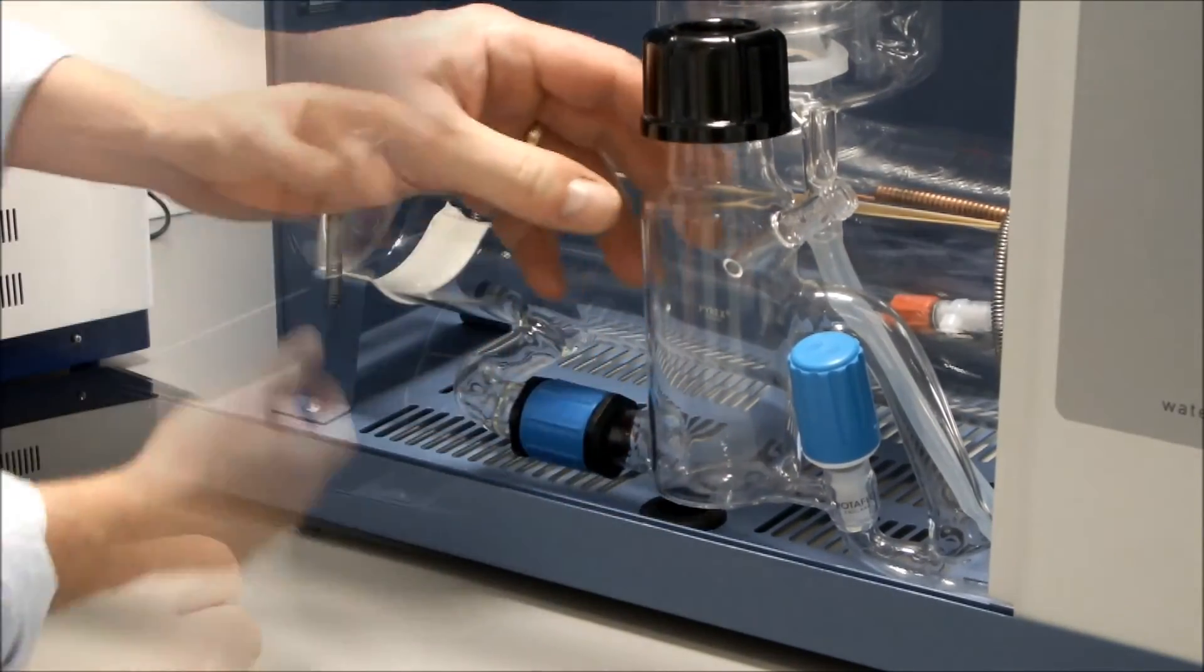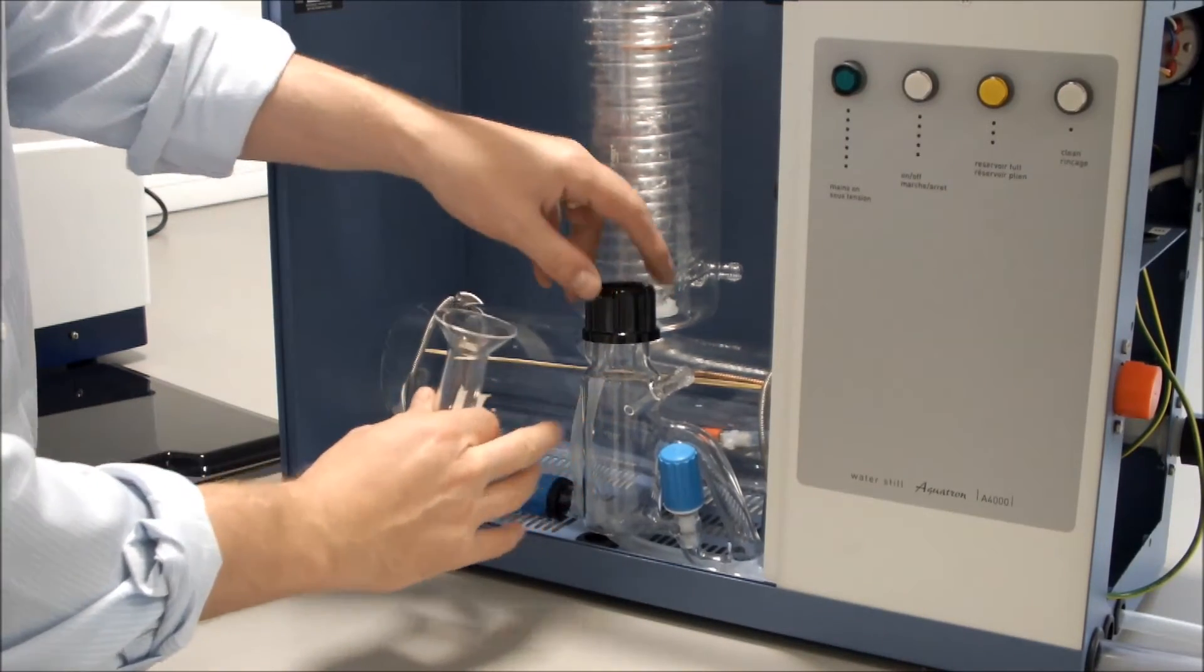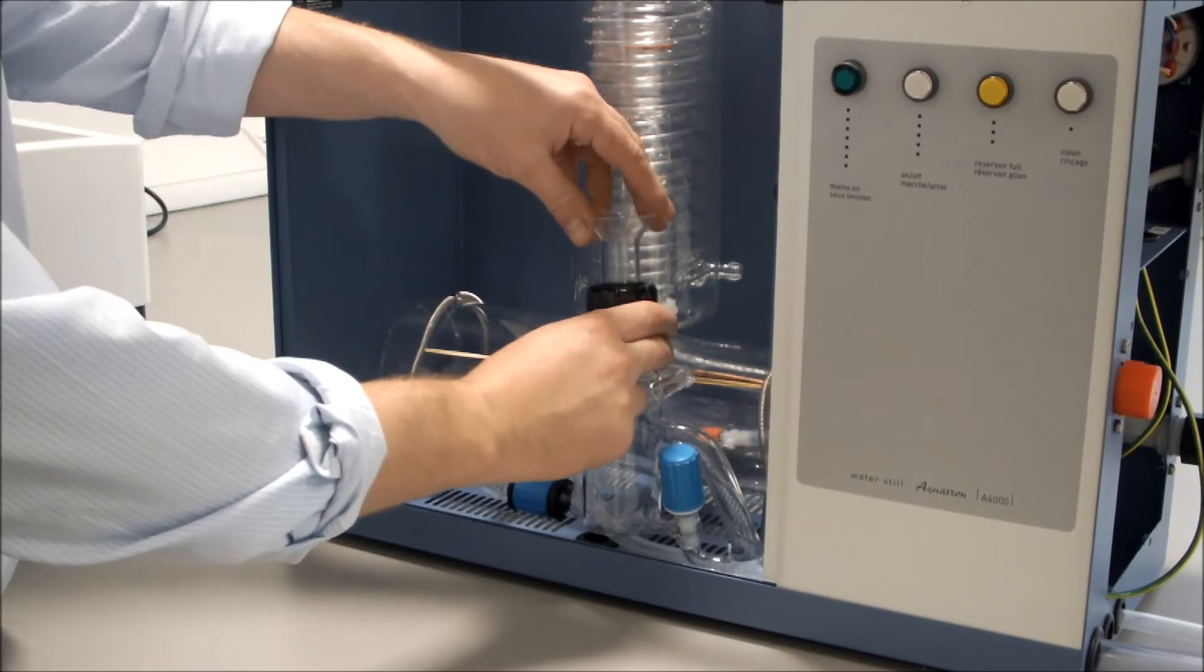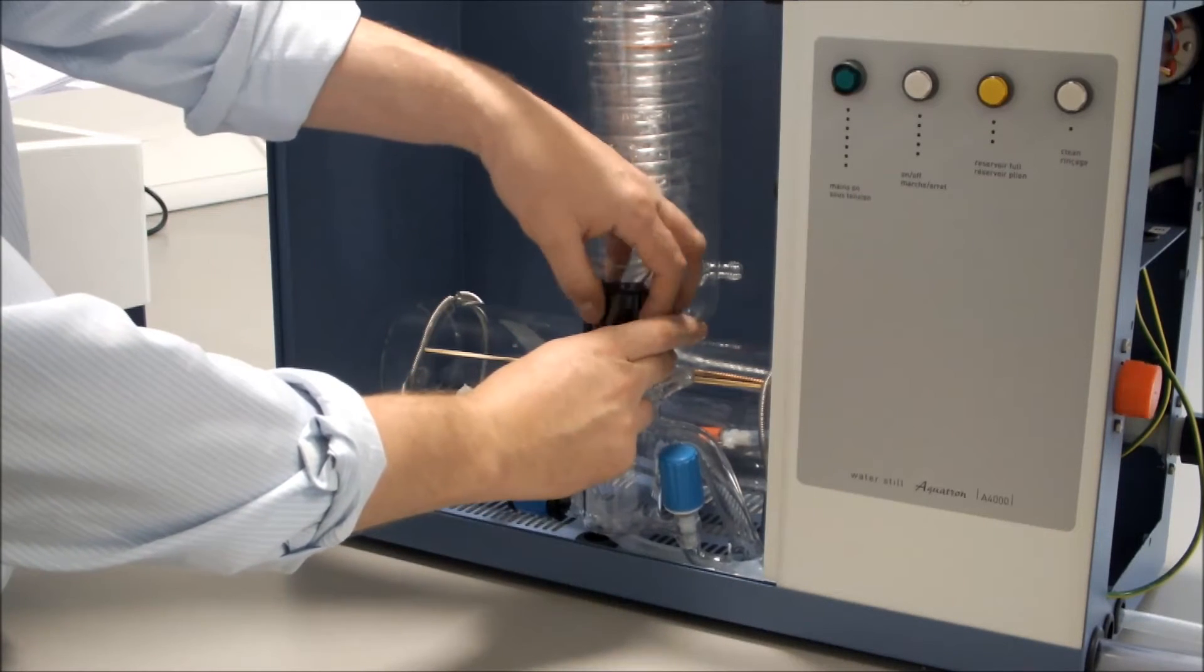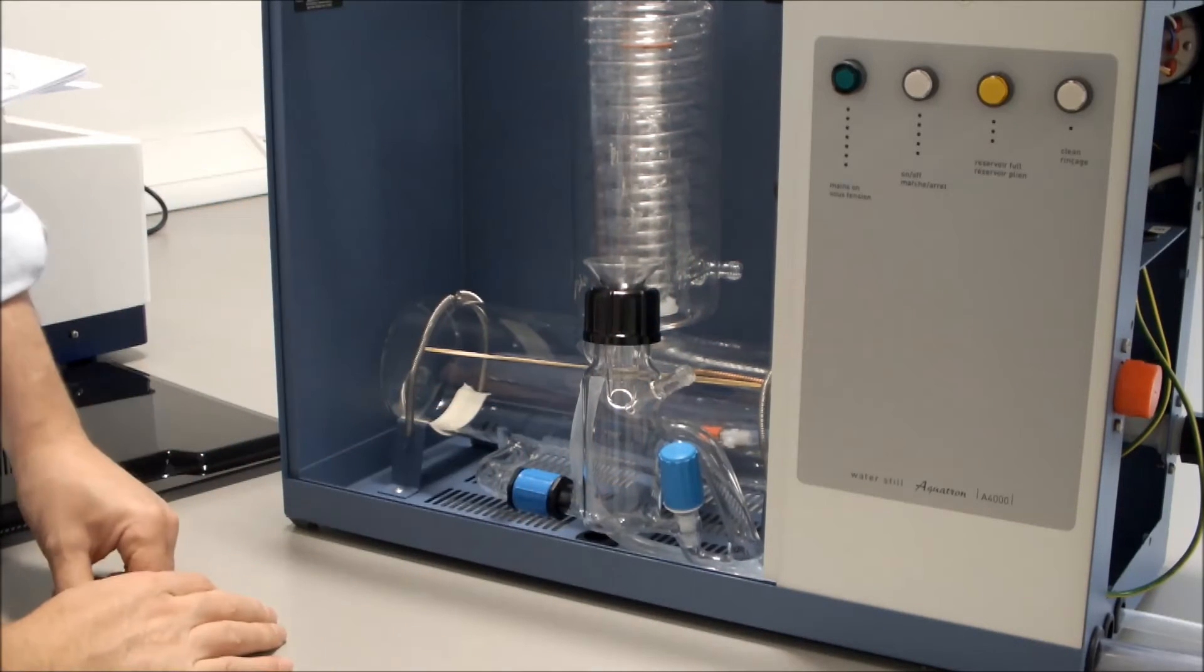Next thing to do is to connect our funnel into our boiler level control. We just ease the black cap off slightly, press that in, and we tighten up.